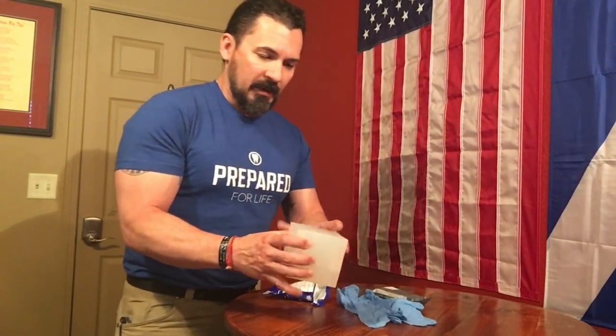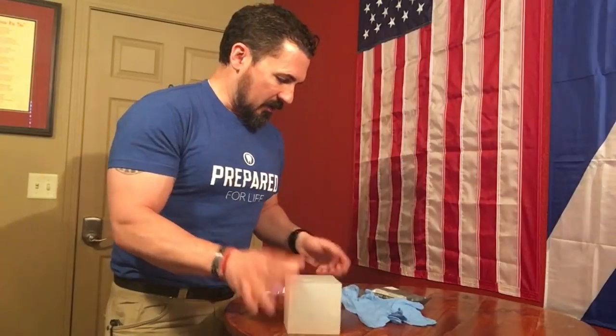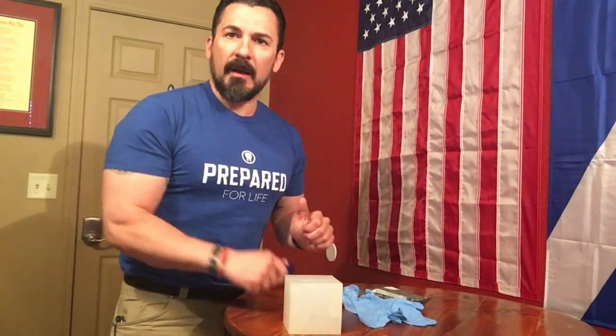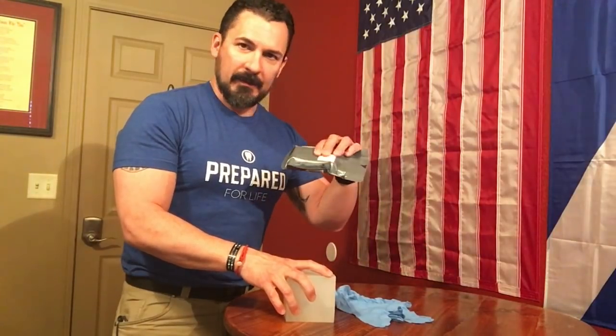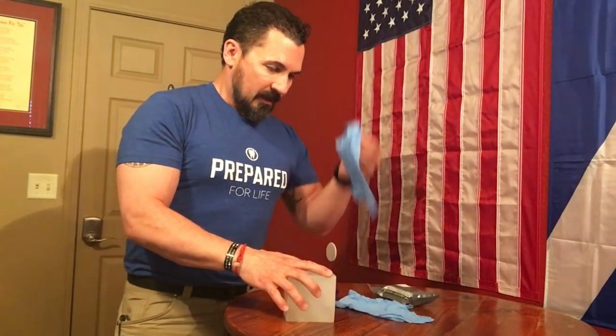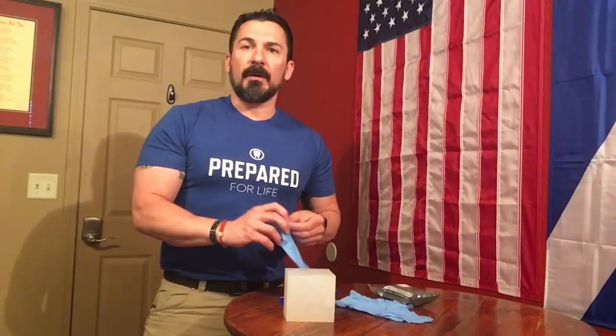So what we're going to do today is utilize one of these wound cubes along with a pack of inert combat gauze, training gauze, and a pressure bandage here. Also got a pair of nitrile gloves as well.